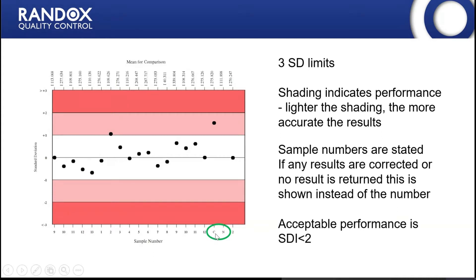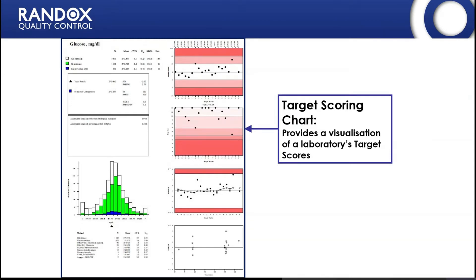There is also an 'R' which shows that results have been removed — this can be done if the sample was reconstituted incorrectly or if results for the wrong sample were entered. This means long-term performance and end-of-cycle reports are not affected by that pre-analytical mistake. You may see an 'R' along the bottom of the reports showing that results for that sample across all parameters have been removed.